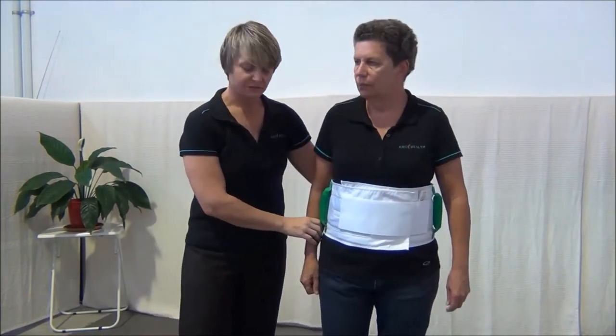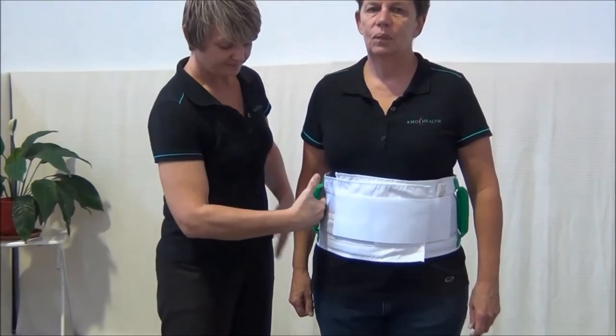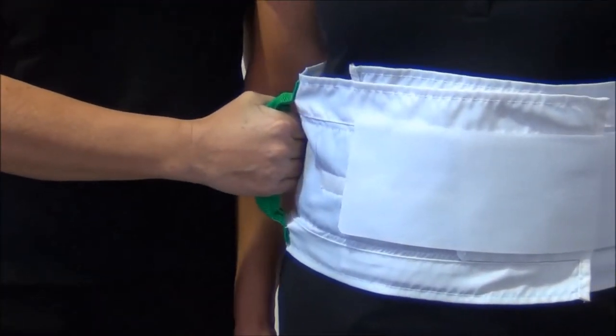The way we use these handles is: you place your hand on the front with a flat palm facing you, fingers only under the handle. You make a fist and gently pull it towards you.